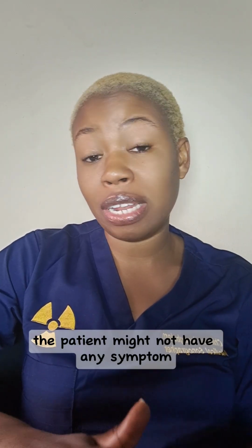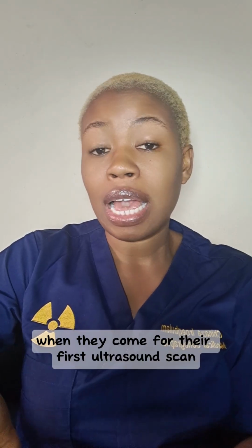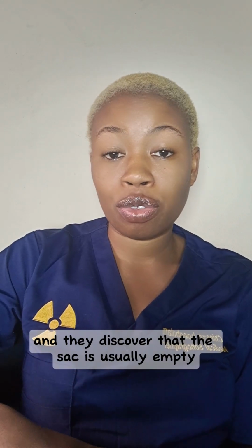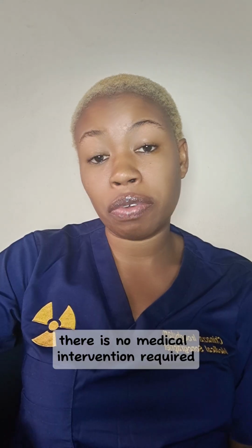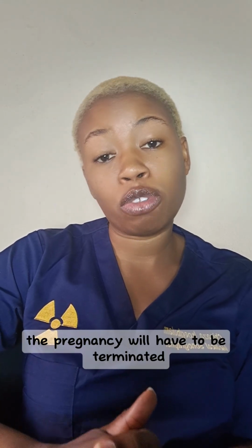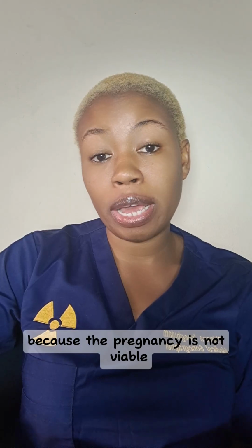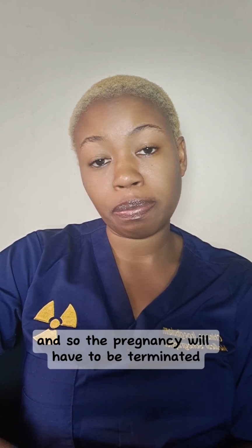The patient might not have any symptom. They only discover when they come for their first ultrasound scan. And in some cases, the patient might have bleeding or spotting, which makes them come for the scan, and they discover that the sac is usually empty. In such situations, there is no medical intervention required. The pregnancy will have to be terminated because the pregnancy cannot proceed. Because the pregnancy is not viable, there is no baby, and so the pregnancy will have to be terminated.